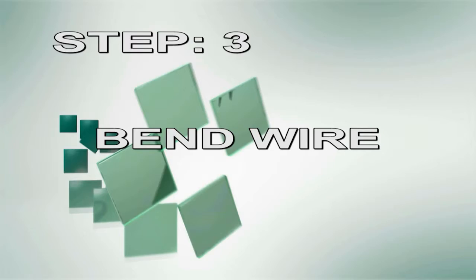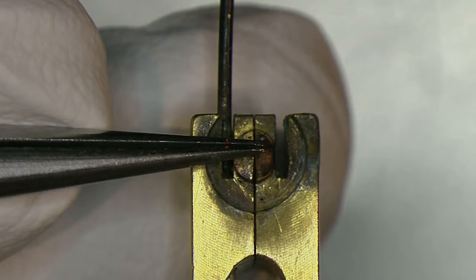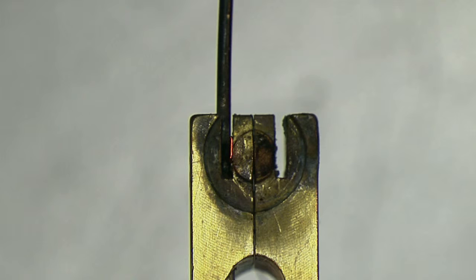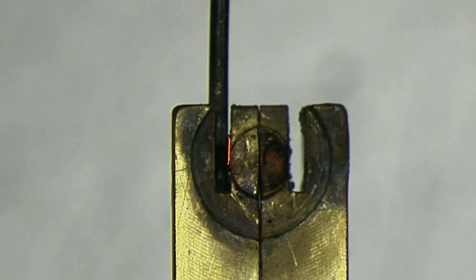Step 3. Bend wire. Using tweezers, form a slight bend that is approximately 2 to 5 millimeters long in the wire. The bend will create more area for the wire to bond to the ring.